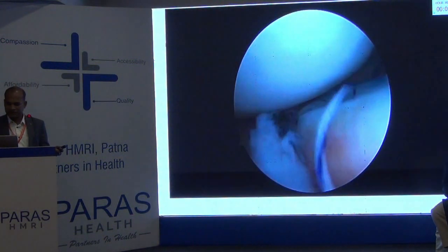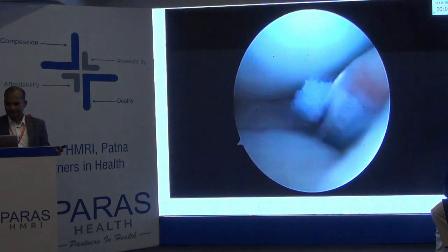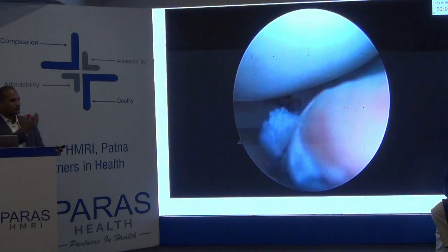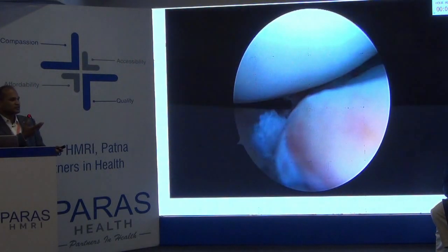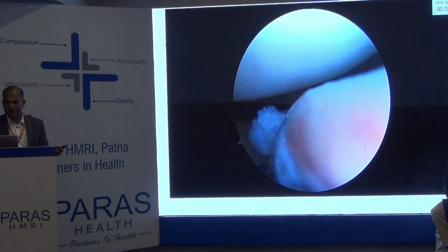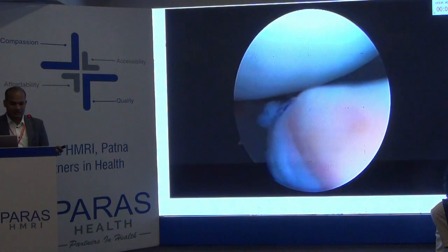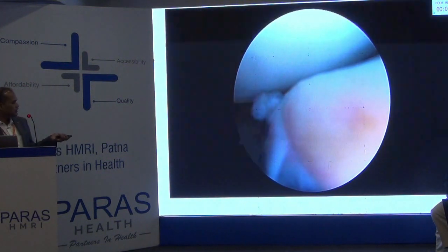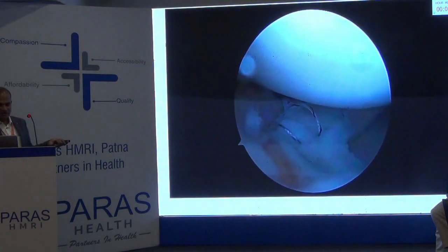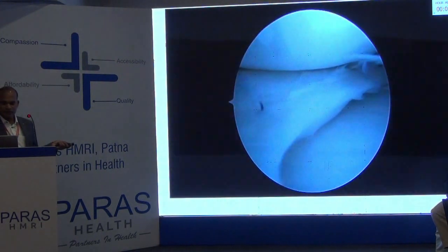And then again this is the fourth one. Interval is usually 4 mm. What do you suggest, Dr. Sunit? Yeah, but it's very difficult to measure the 4 mm. So sometimes you may be very close. That's happened in this case also. You can see these two stitches are a little bit closer, but ideally it should be at 4 mm.